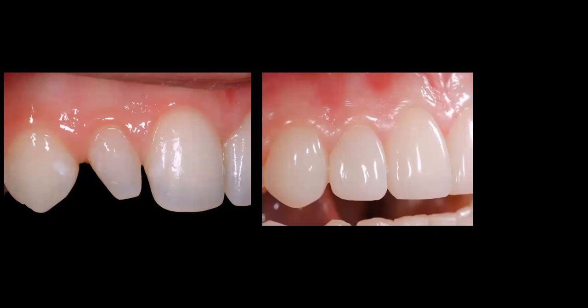But when we injection mold, we injection overmold usually most or all of the tooth, and then we have to teach the doctors how to quickly and safely sculpt the extra composite away that's in the injection zone, and then maintain the Bioclear zone, which is an everyday job for Bioclear dentists. It's new to a lot of people watching today, but if you do Bioclear every day like I do, it's just like getting up in the morning and having a cup of tea. It's just what we do.